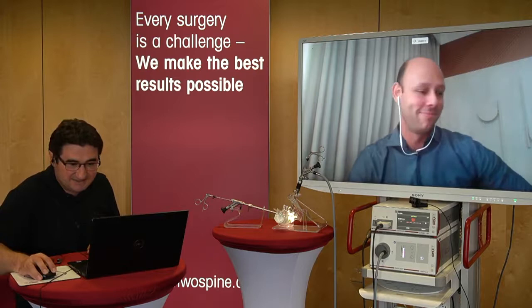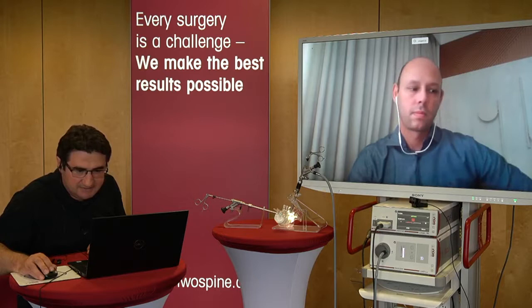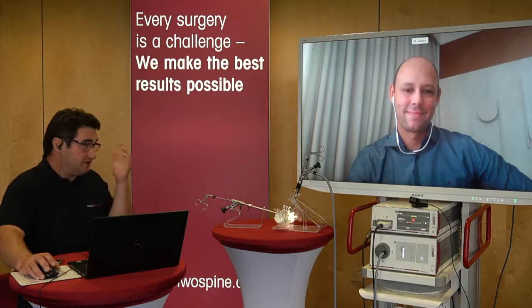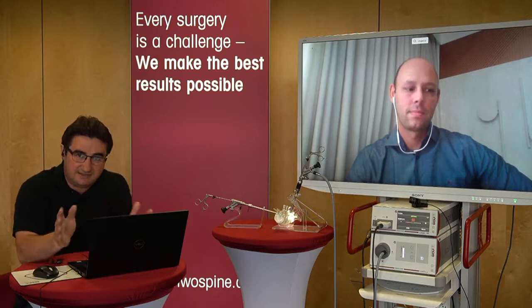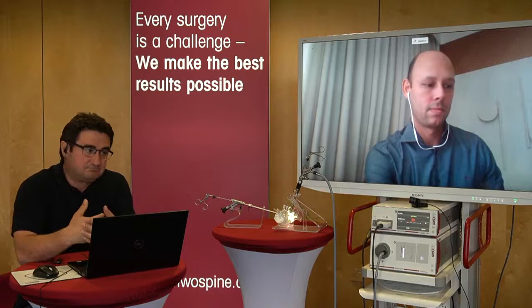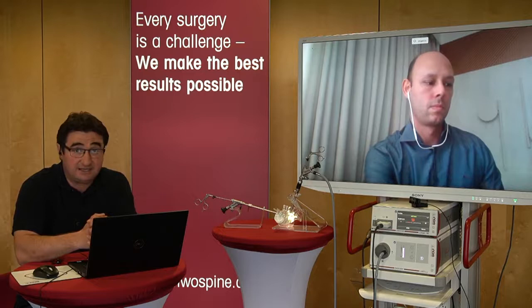Let me check if we have another question. Questions for RIWOspine. They are asking: what are the indications for using the anterior cervical approach, in your opinion? You already answered this question. We choose the posterior approach for the lateral herniations, and if you want to do discectomy for the central herniations, you can choose the anterior approach. But personally I don't have too much experience with anterior surgery. But we know that our colleagues from Asia do a lot of anterior surgery.